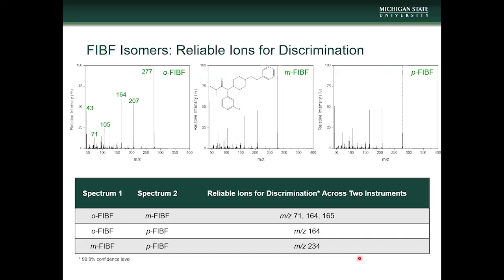So the data that I presented on the previous slide were all from a collection in 2019. In 2022, we purchased more of these FIBF isomers. We prepared them and then we analysed them on the instrument in our lab. So another instrument analysing these samples maybe 3 or 4 years after the initial collection.